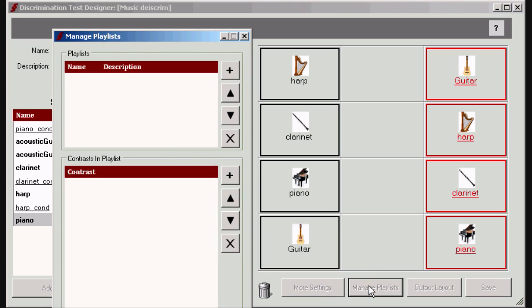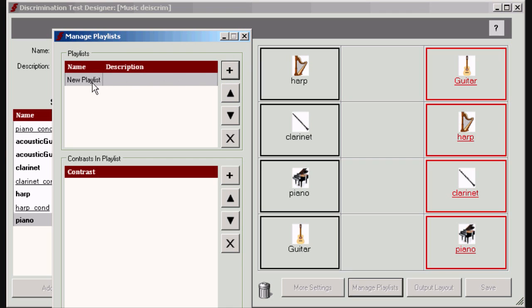You can define playlists. These are lists of contrasts that will be played one after the other. First create a playlist and give it a name and description.